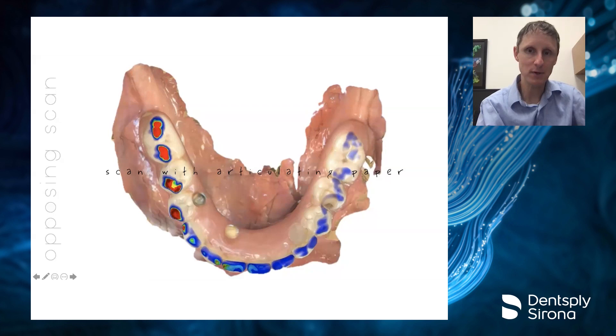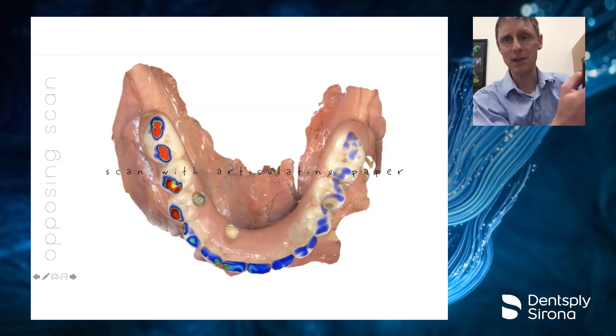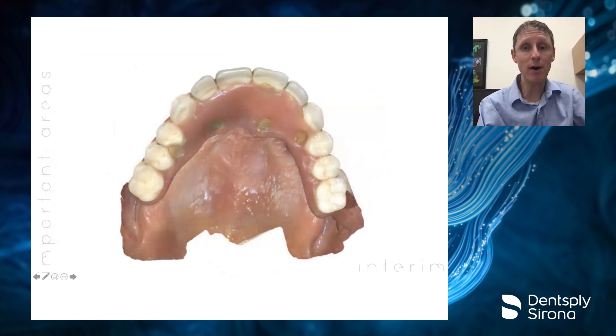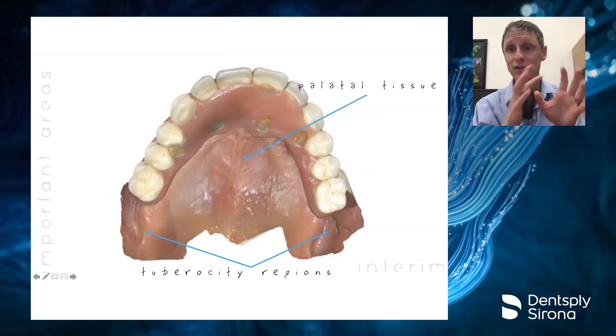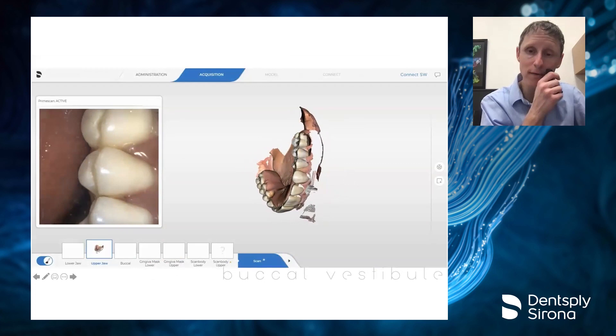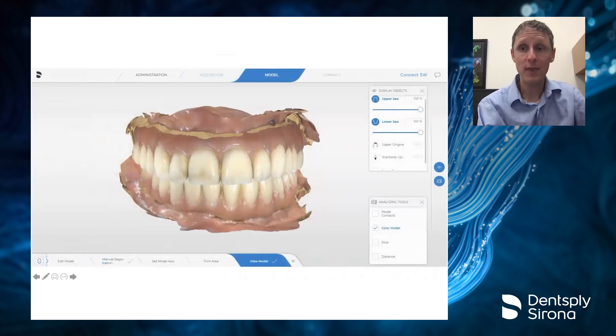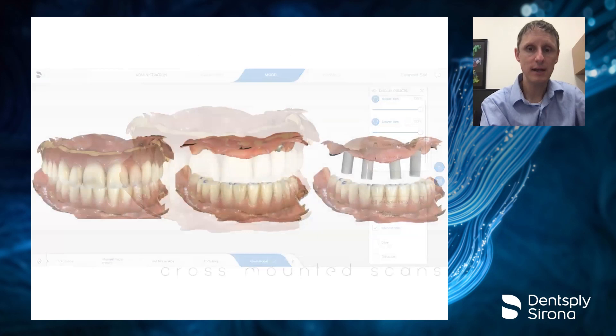For the upper arch scan, the important areas are the tuberosity regions and the palate, where we've got a lot of good tissue. When scanning the buccal vestibule, put your scanner in there and have the patient close slightly — that gives you a little more space to get in and scan those areas. All this data goes to the lab and is sent over to them, with everything cross-arch mounted exactly where we want it and a verified bite.